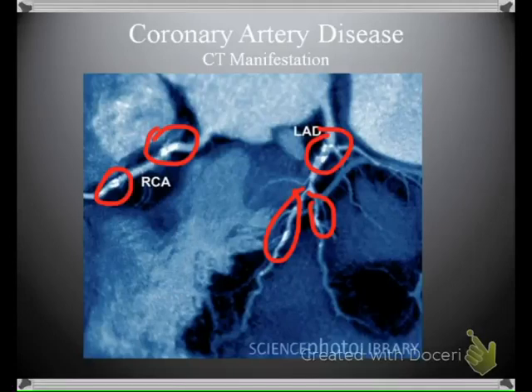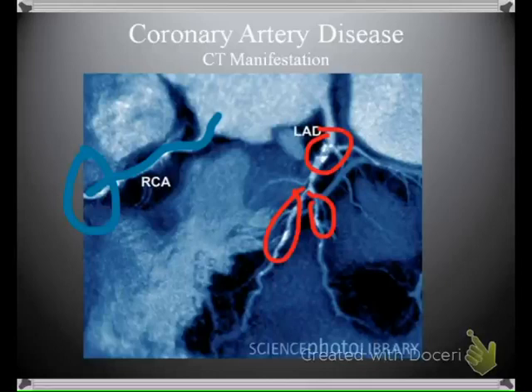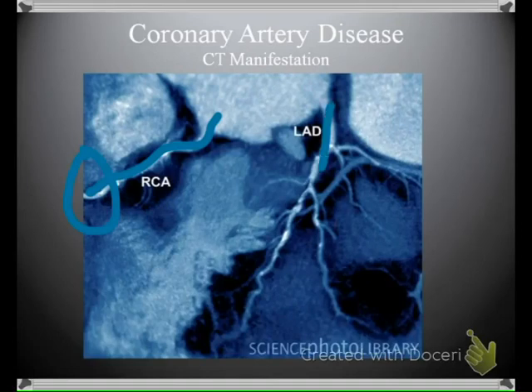However, what we don't actually have the ability to do is gauge whether these areas of plaque are causing a stenosis. Once again, we're still relying on a filling defect, which there does not appear to be, simply because we have contrast extending out here, coming all the way here. And also we have contrast flowing down through all the bifurcations at this level as well.